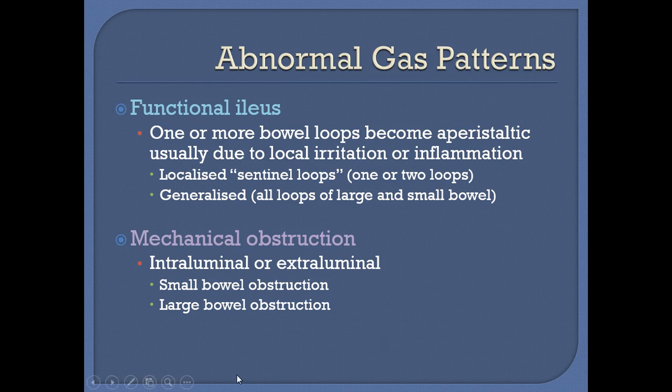It can cause mechanical obstruction and it is intraluminal, and it can be extraluminal, means some enlarged lymph node, some mass, some retroperitoneal tumor or some intraperitoneal tumor can cause compression over the bowel loops, resulting in proximal bowel loops obstruction. Mechanical obstruction also can be of a small bowel or the large bowel.